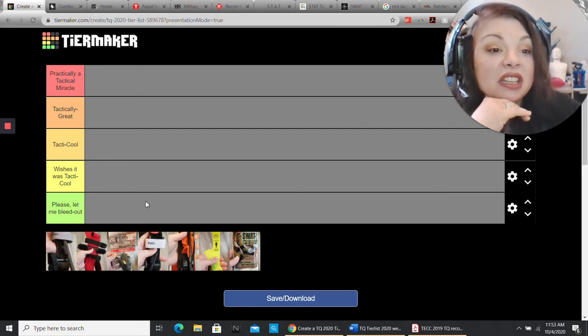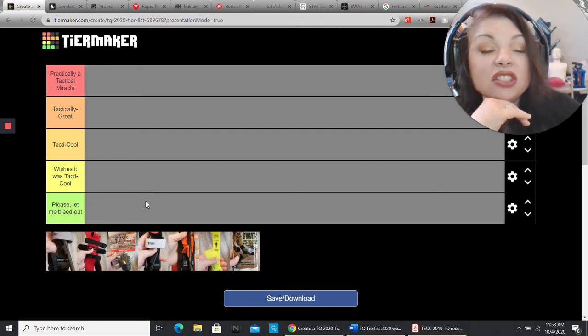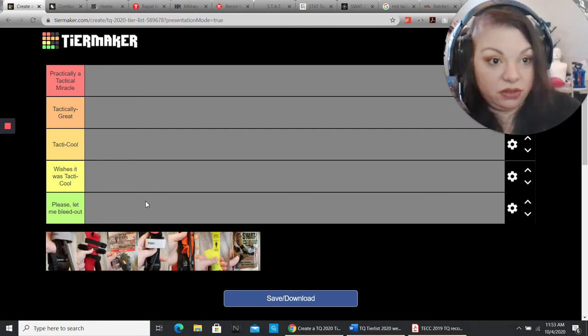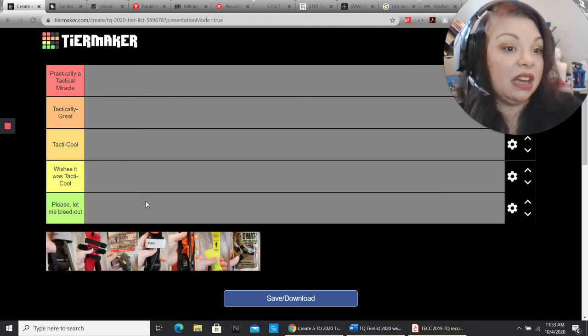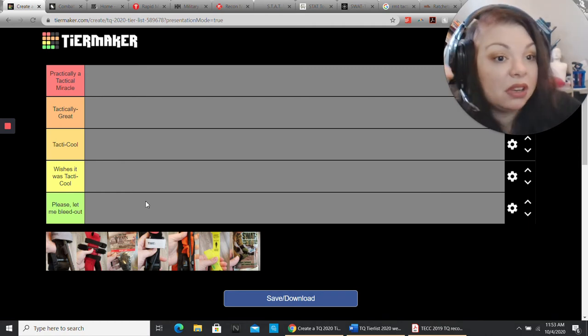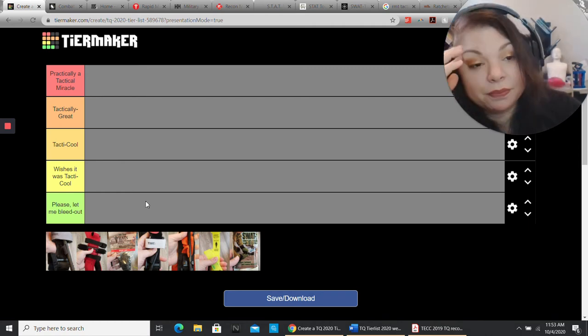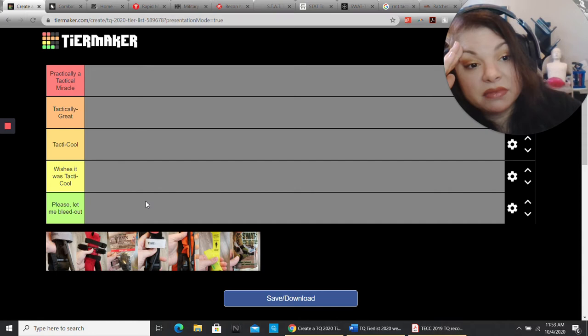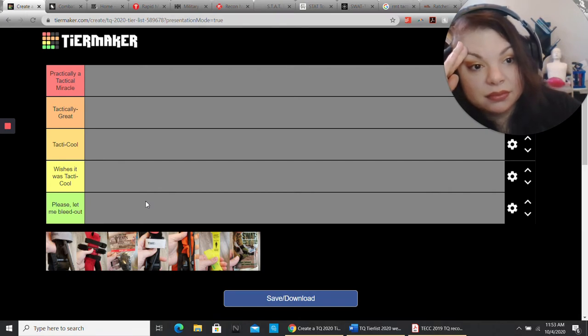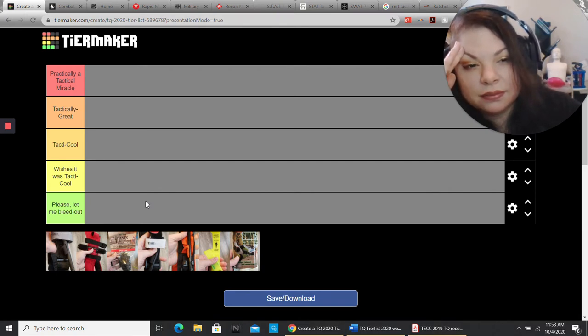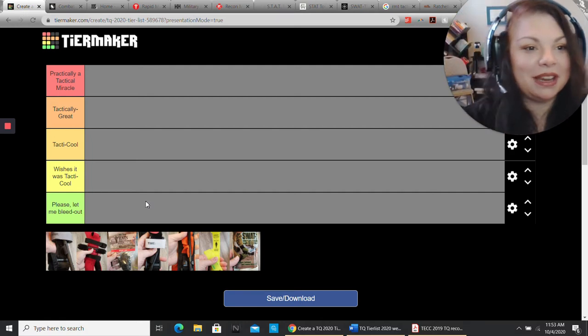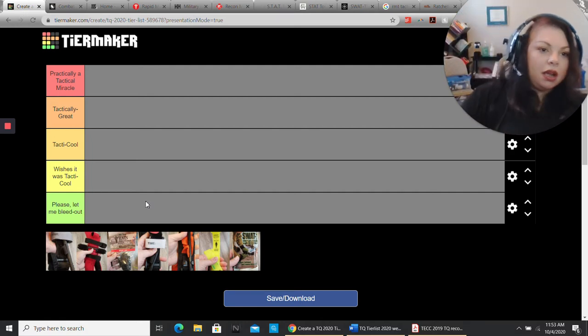Wishes it was tactical means it's worse than tactical. It aspires to tactical. It's not there. It's not even close. Please let me bleed out means exactly that. Just don't even touch me with that thing. I can do more with gauze than I can do with this thing.